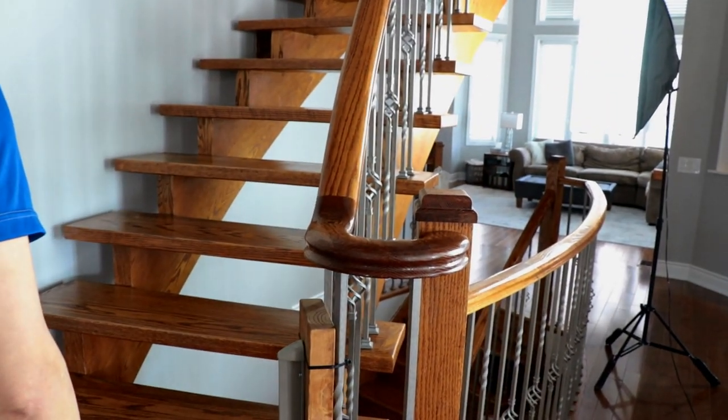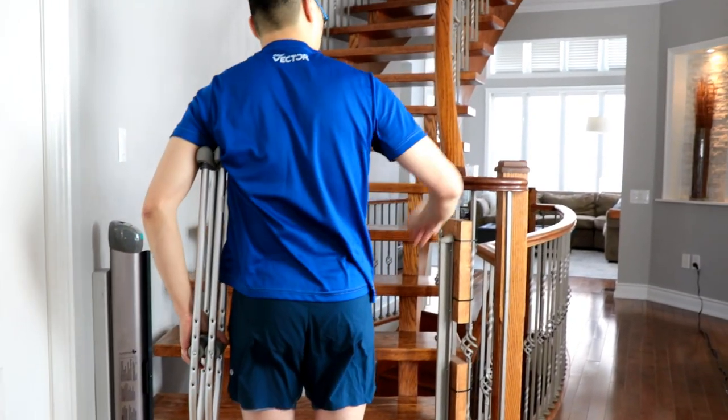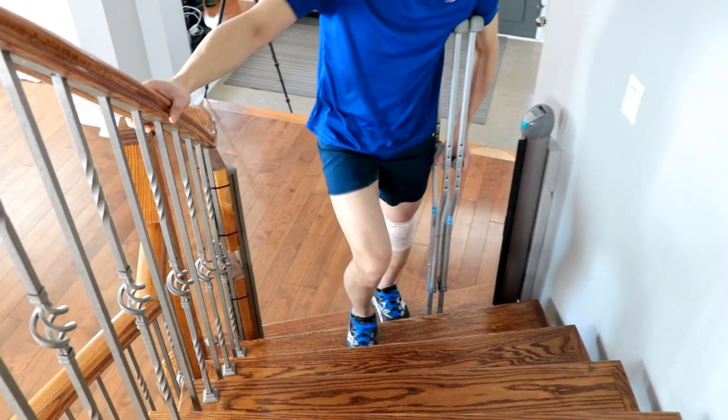When there's a railing available, you may wish to take advantage of it. To do this, simply put both crutches under the opposite arm. The crutch still moves with the injured limb and the railing can be used for additional support.